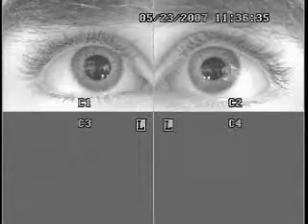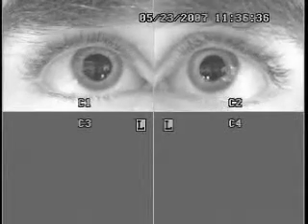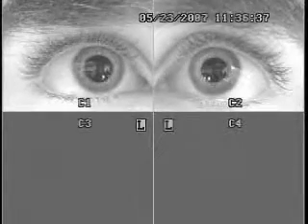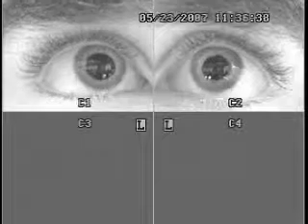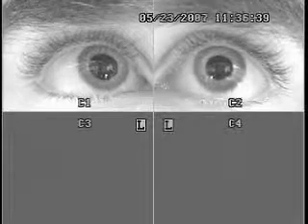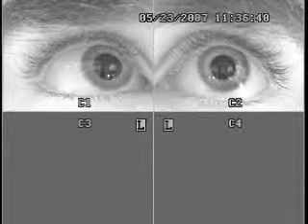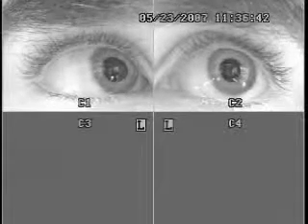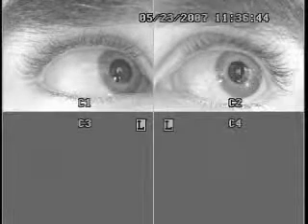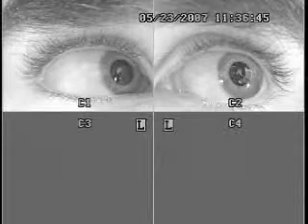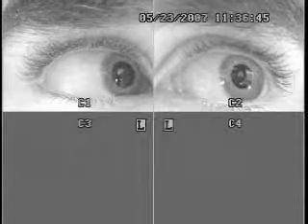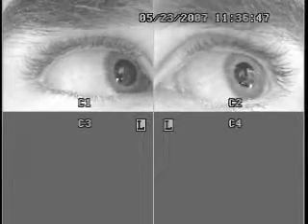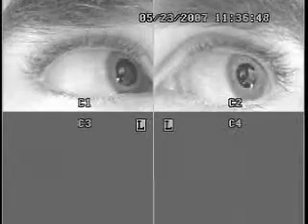Now we're going to check for onset of nystagmus prior to 45 degrees. Just keep looking right at the bead. You're doing great.